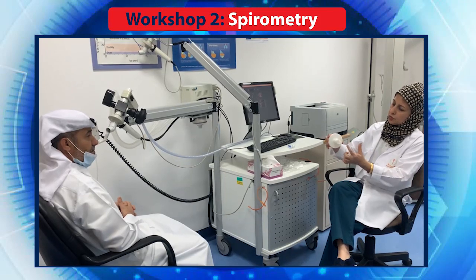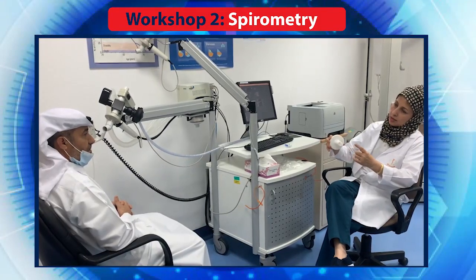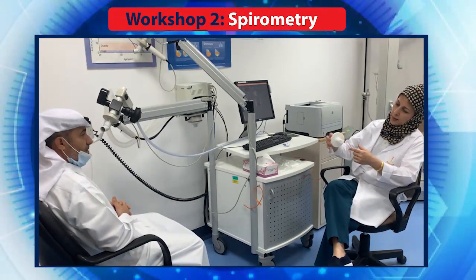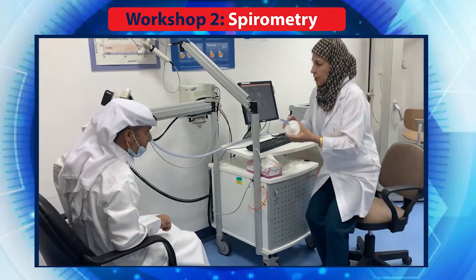So what you do, you have to make a tight seal around this with your lips, and make sure you don't close the hole with your teeth or your tongue. Okay? So we're gonna start. So I'll put it here.